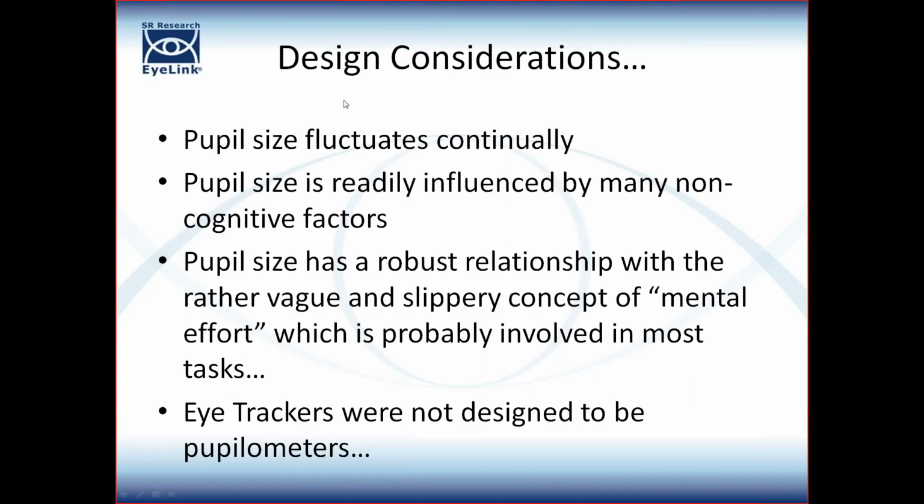So let's move on now to considerations for our experimental design. We know pupil size fluctuates continually, so we need to take baselines.